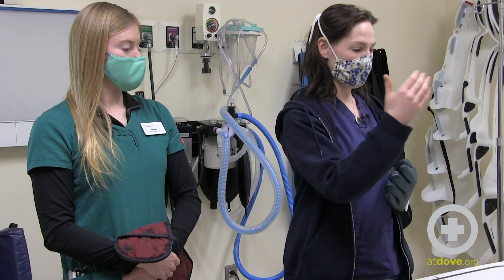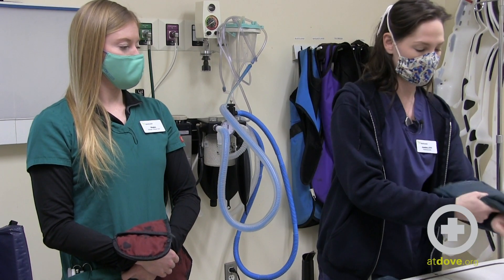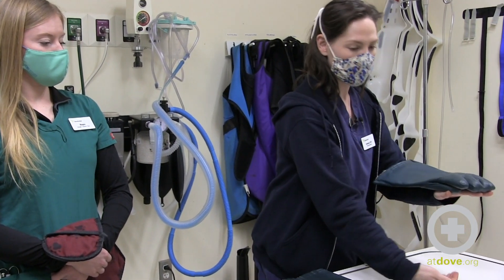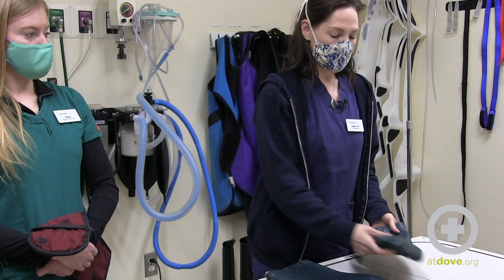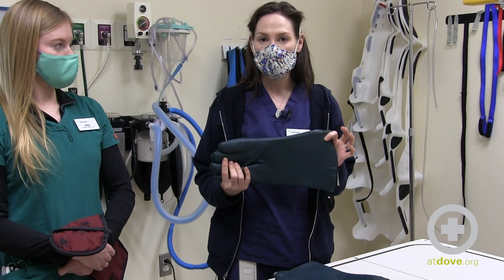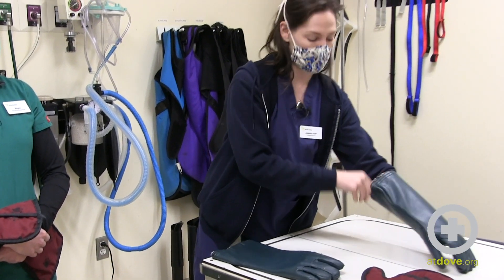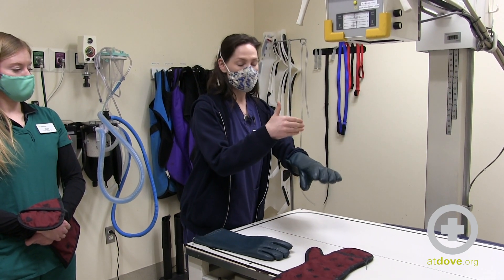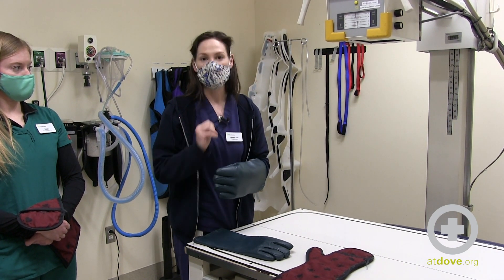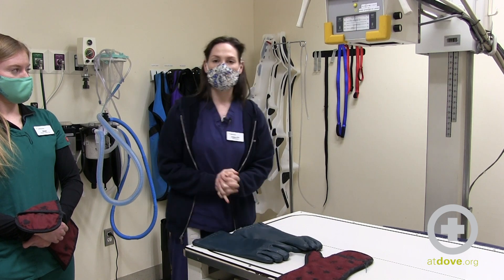Scatter radiation is exactly what it sounds like — radiation that scatters around. It may scatter and hit the table, or hit the plate underneath the table, and scatter back up. If you have your glove just on top of your hand, that scattered radiation can bounce back from underneath the table and hit your hand. These gloves are only meant for scatter radiation — they are not meant to be in the direct beam or in the area where the light hits the x-ray table, which is potentially the direct beam area. The beam going through the glove will be absorbed into your hand more slowly, but keep your hands — gloved or not — out of the beam.